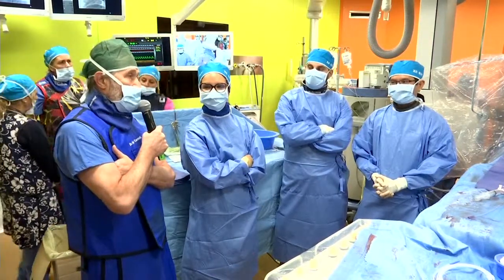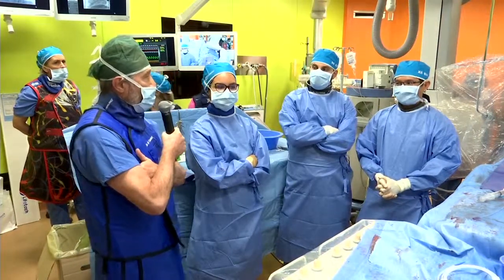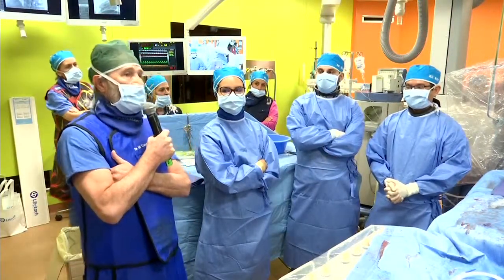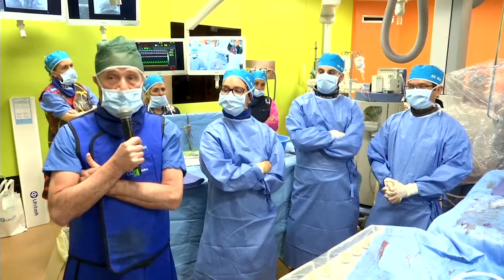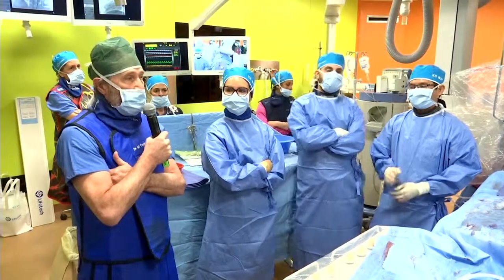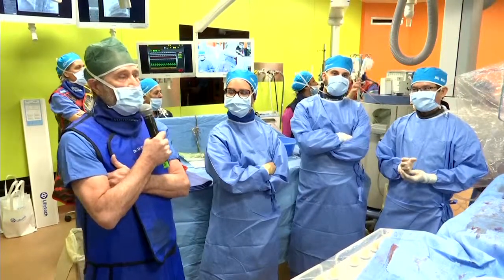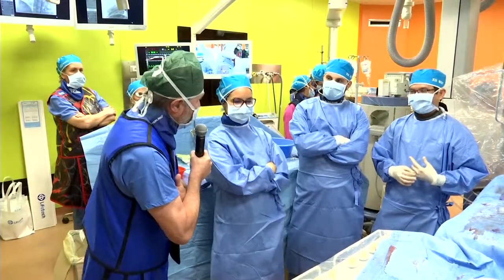There are also other devices, of course, Occlutech, as you mentioned. Well, the new MFO from LifeTech is also very useful. We started very recently, with very, very promising results. But I think this is an example where the high muscular VSD, as I would call it, can be closed very, very successfully with the ADO1, as you did. Congratulations, guys. Yeah, thank you.